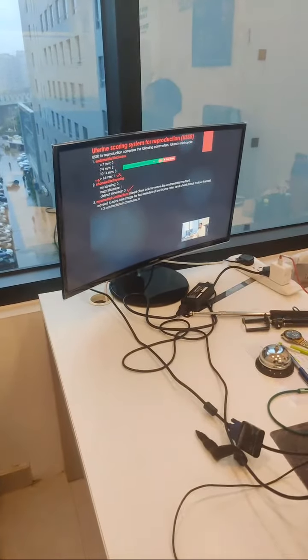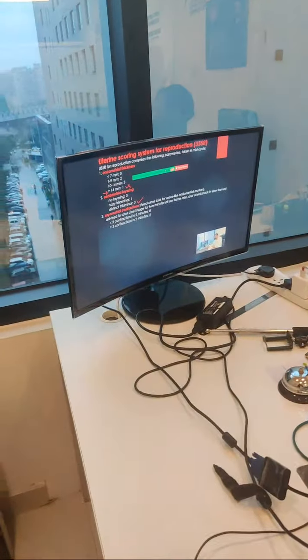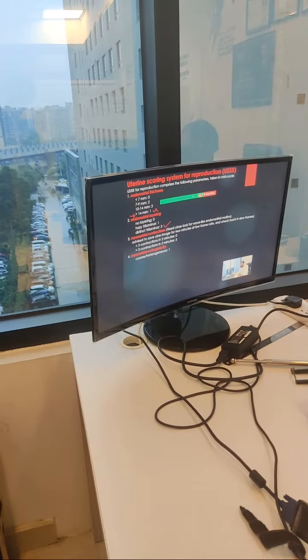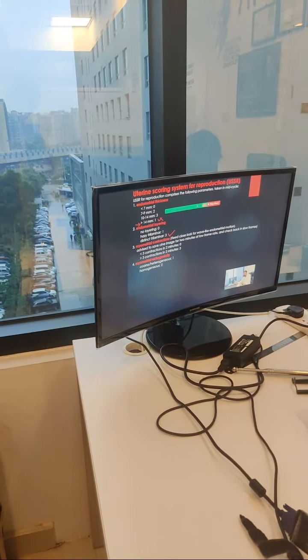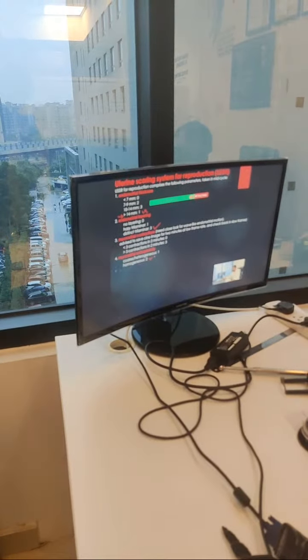And if contractions are less than 3 in 2 minutes, 0. If there are 3 contractions in 2 minutes, straightforward 3 points. Then the myometrial echogenicity. If myometrial echogenicity is coarse or heterogeneous, only 1. And if it is homogeneous only, then I will be giving 2.